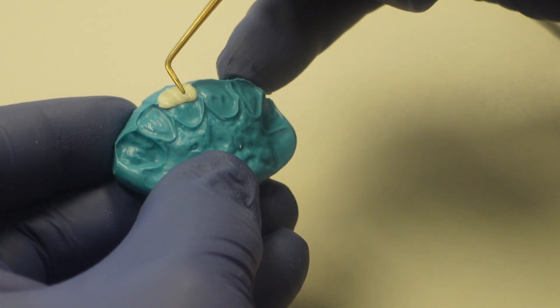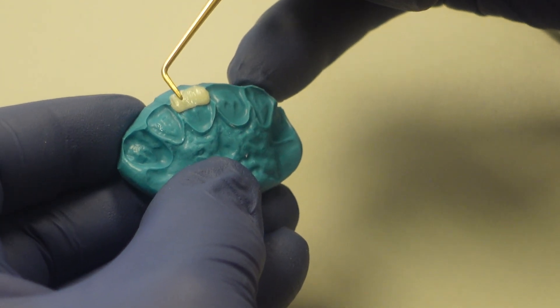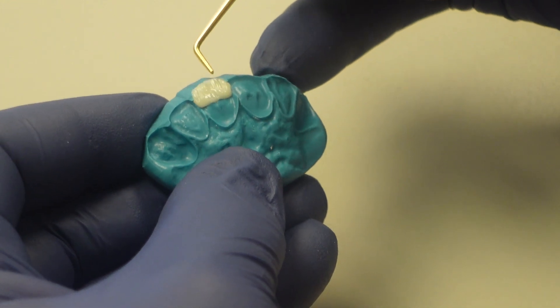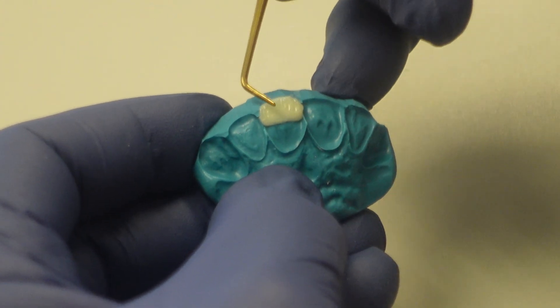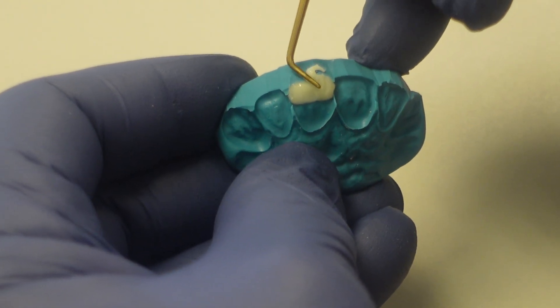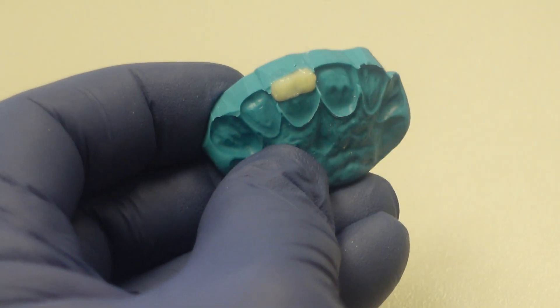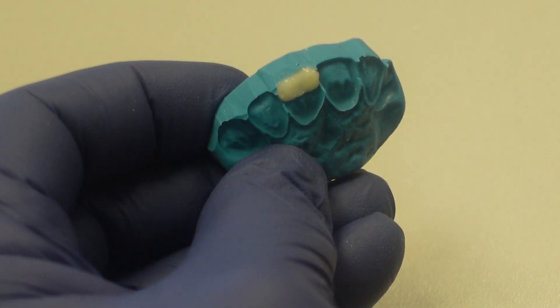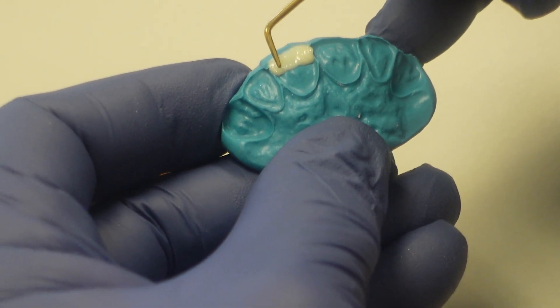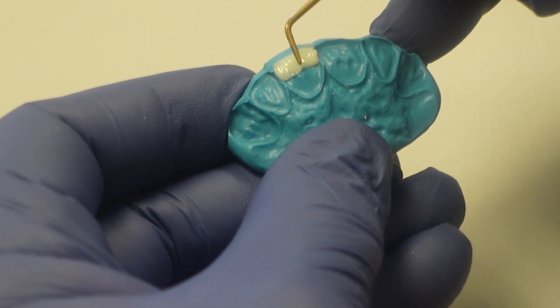If I was doing multiple teeth, I would just go across all the several teeth and end up adapting it as I'm doing right now. This is using the Cosmonet Multi-Use Instrument, which is also one of my two absolute favorite instruments. And you can see how I'm just sort of cleaving away a little excess material here.